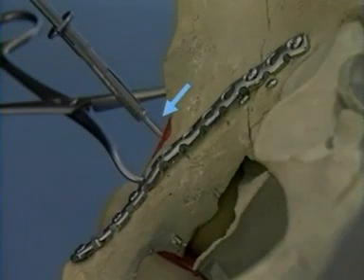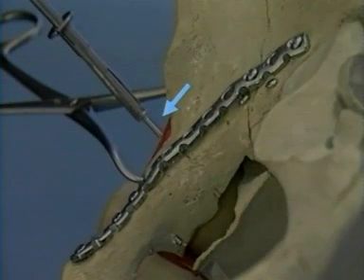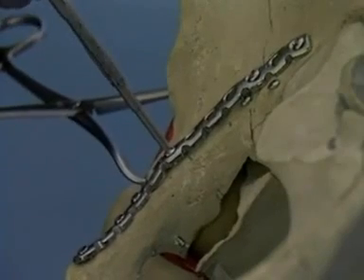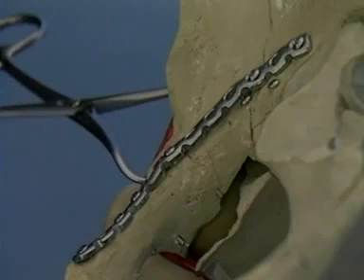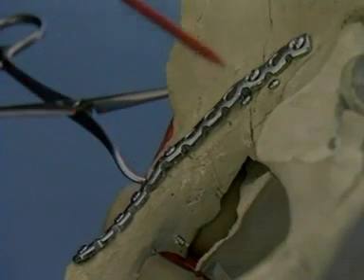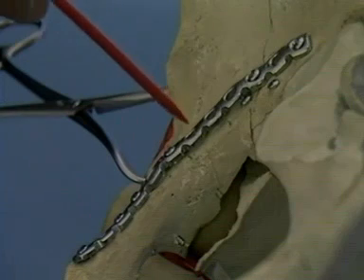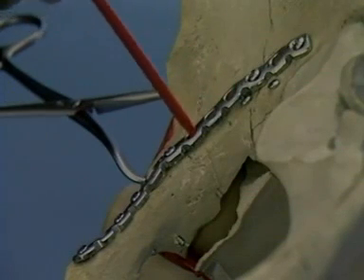Only very short screws should be used over the pectineal eminence to avoid entering the joint. It is not necessary to fill all the plate holes; in fact, several holes must be left open for posterior column fixation following the reduction.